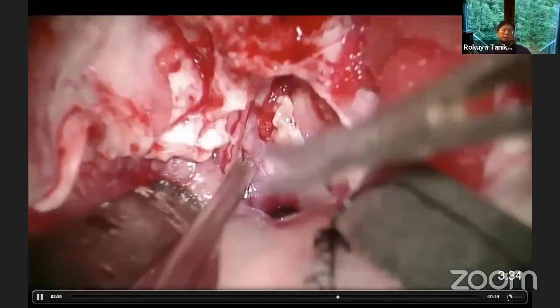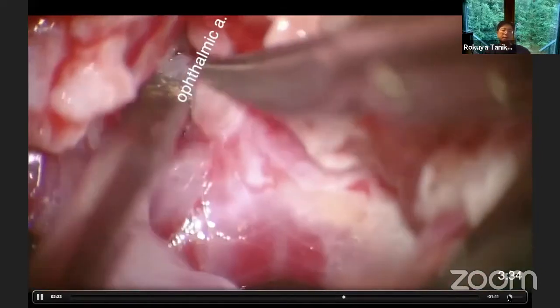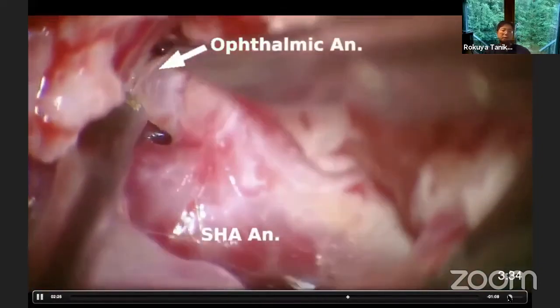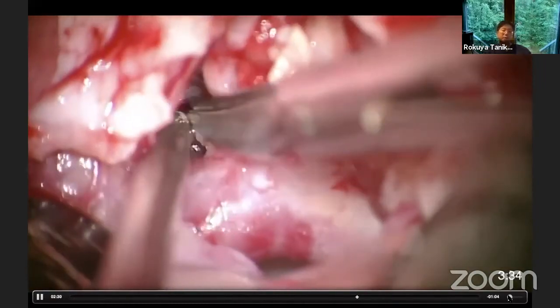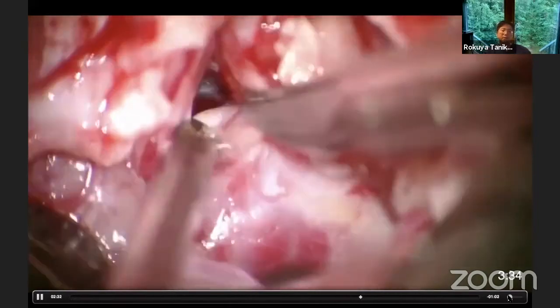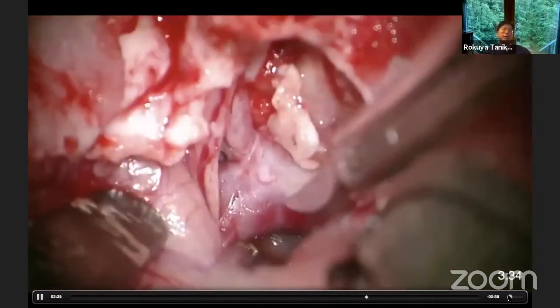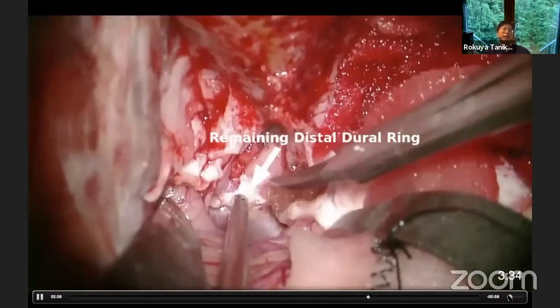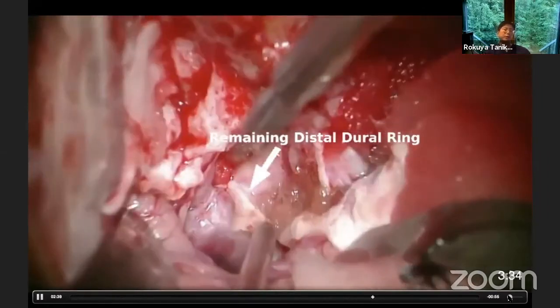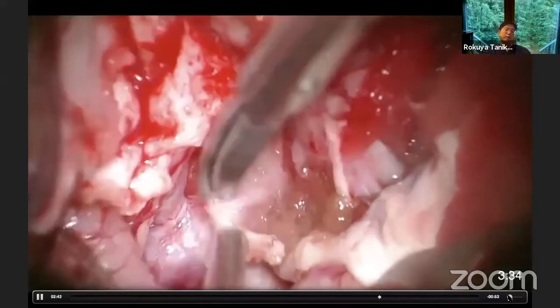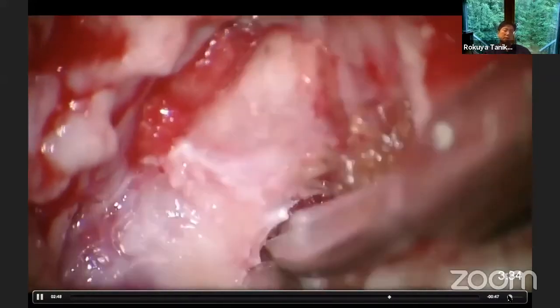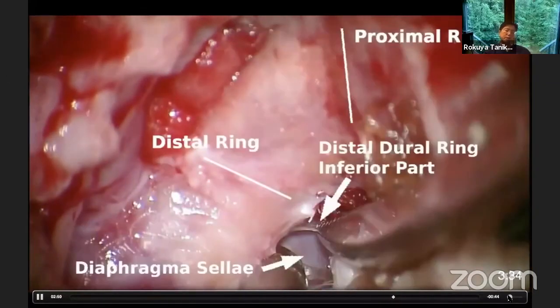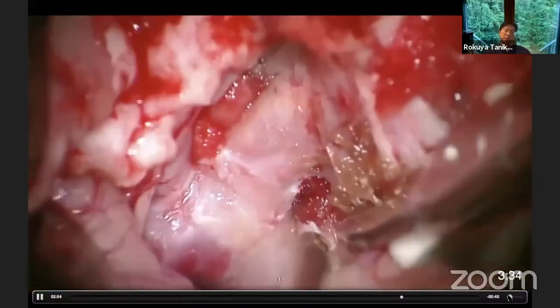Now almost all preparation is done. Then you can approach the aneurysm. The tiny aneurysm at the ophthalmic artery origin could be found — to be honest, I couldn't recognize it in the preoperative angiogram. This is the remaining flap of the distal dural ring, which can be detached from the carotid wall with sharp dissection. Now we can confirm the anatomy: the distal dural ring and the ophthalmic artery.